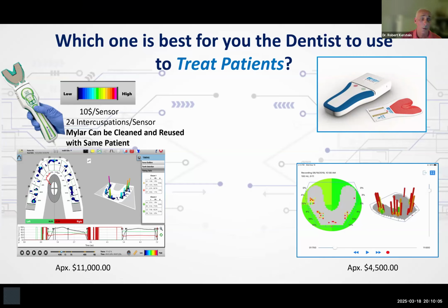So if I made 3 recordings in a consultation on someone and the patient decided to come back for treatment, I could reuse that sensor another 21 times, right? So that's really a valuable thing because the sensors can be reused if needed, within limits. If you used it 20 times on someone, you don't want to reuse it. But certainly it has a very good lifespan, and it holds up very well to intercuspation.